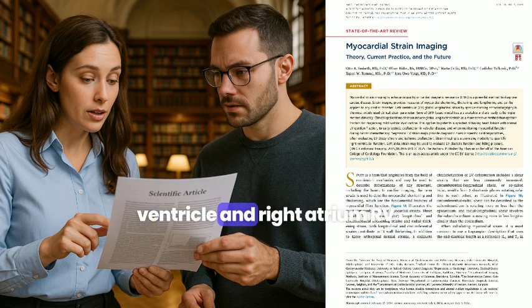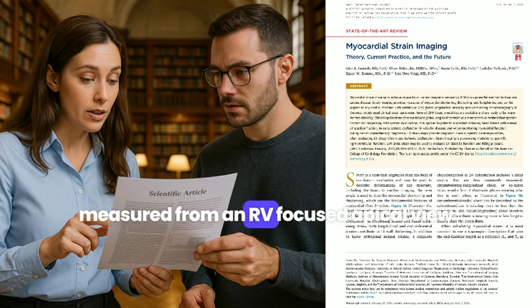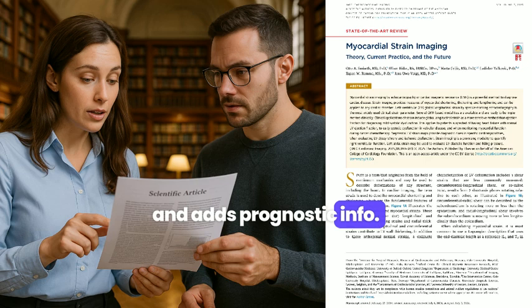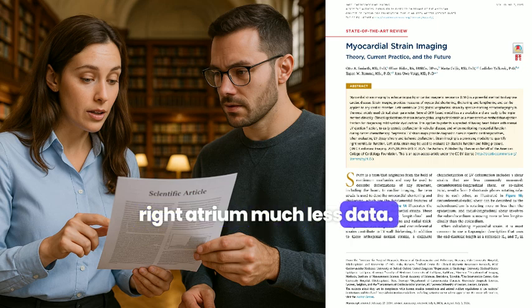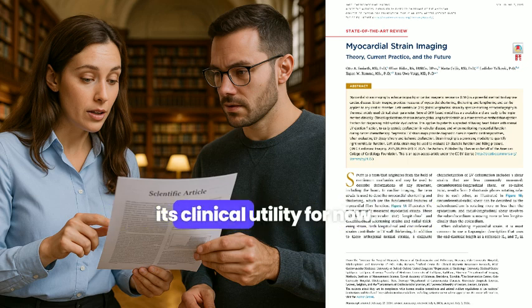And the right ventricle and right atrium. RV strain is gaining traction. RV free wall longitudinal strain, measured from an RV-focused apical view, seems valuable for assessing RV function in cardiomyopathies and adds prognostic info. Again, need careful ROI on that thin wall. Layer analysis isn't feasible. And the RA. Right atrium, much less data. Normal ranges seem extremely wide in meta-analyses, which might limit its clinical utility for now.